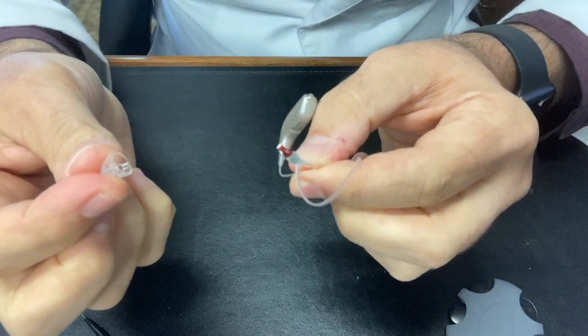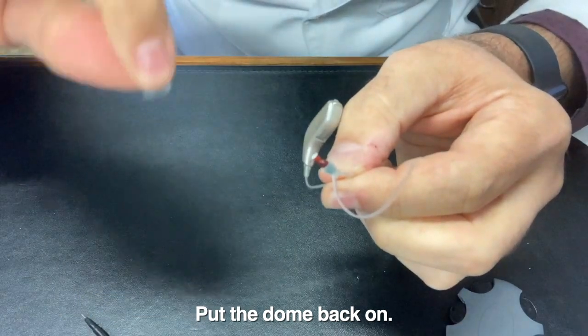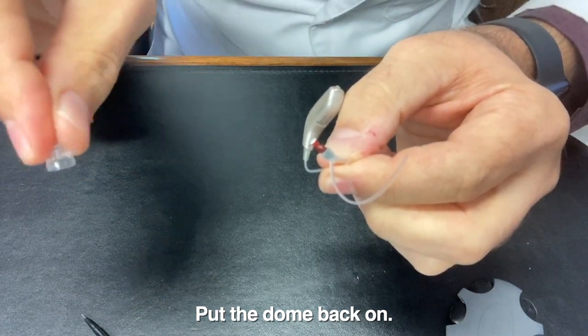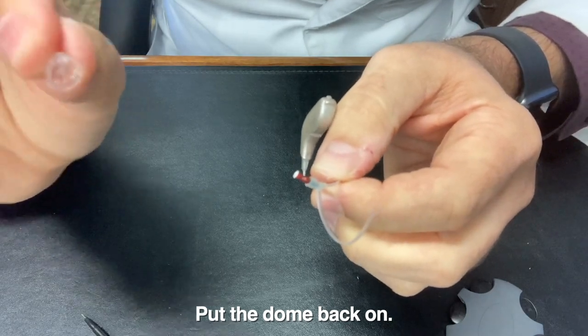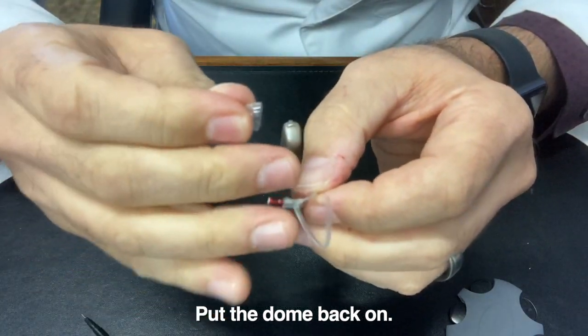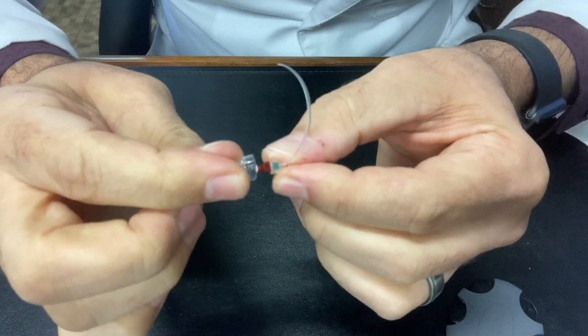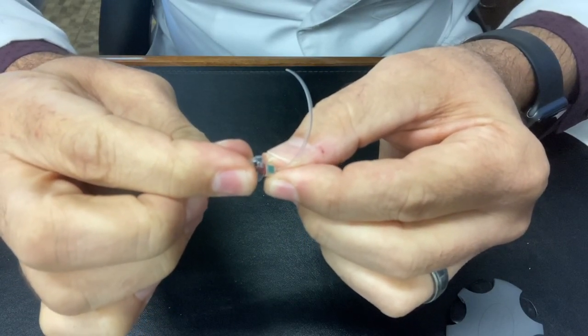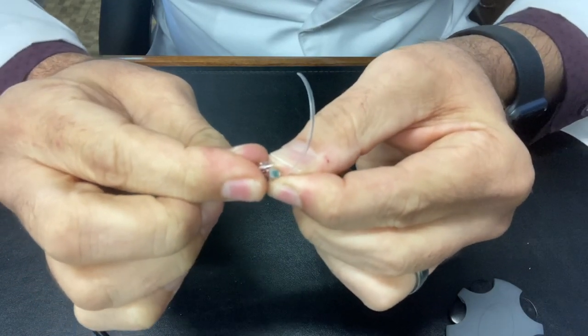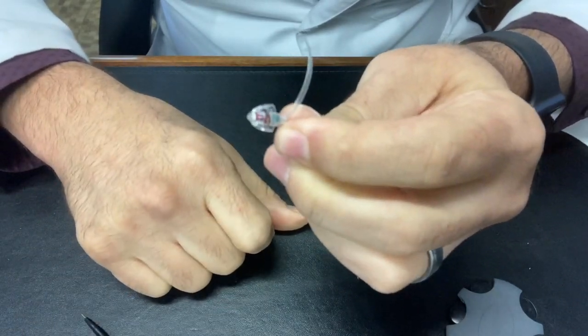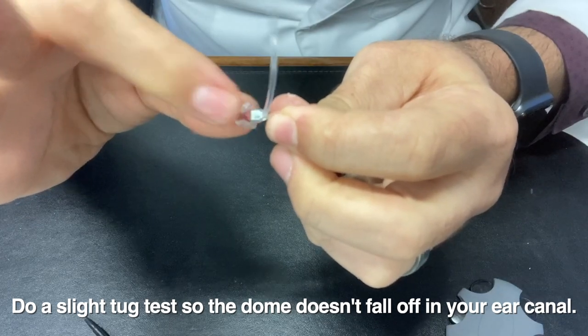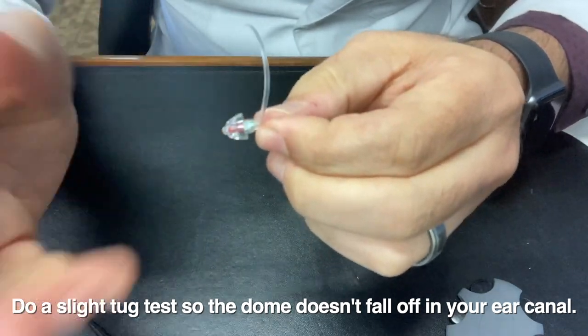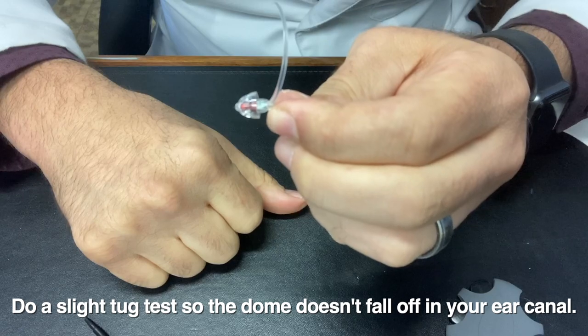Now you have to put the dome back on. I like to grab it just like this and then look underneath. There's a little grommet right in the middle of that bell there. You have to line it up just about perfectly and then wedge it onto there. If you've done it correctly, you should be able to do a slight tug test to make sure it's not going to fall off in your ear canal.